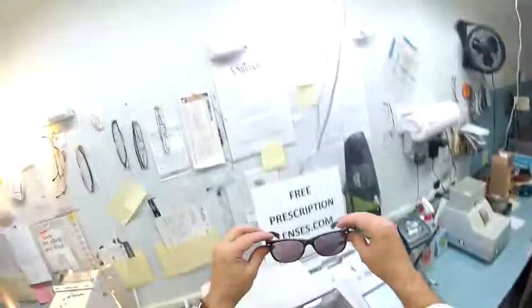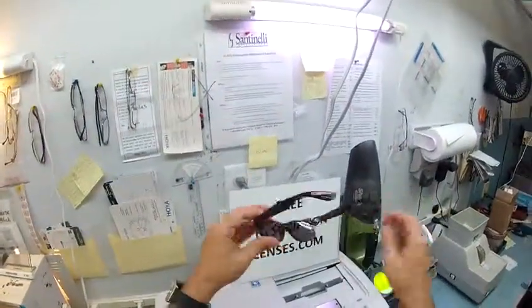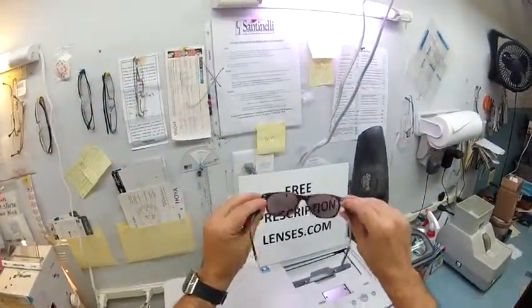So that is that. I've pulled them out. This is what they look like dark, and again, they're going to continue to darken for the first couple weeks till they get to their final setting.